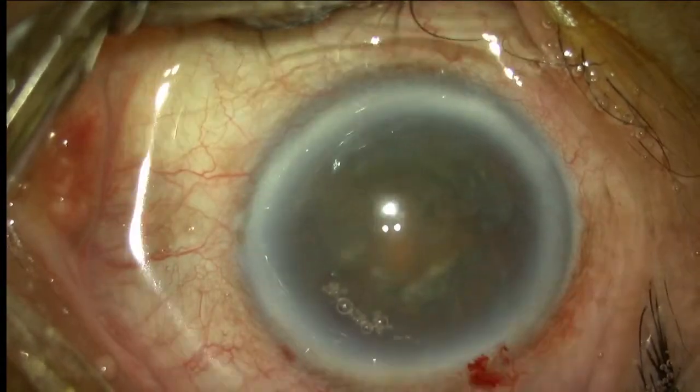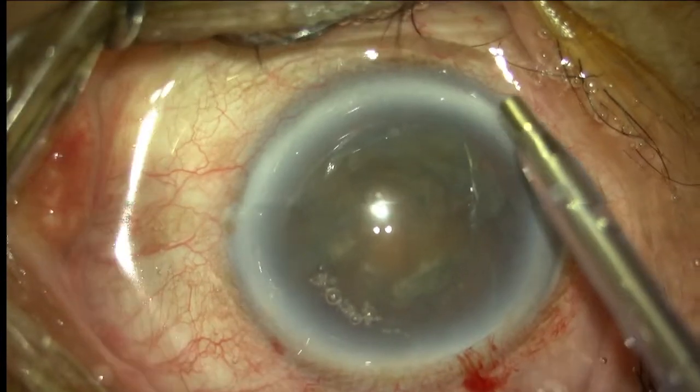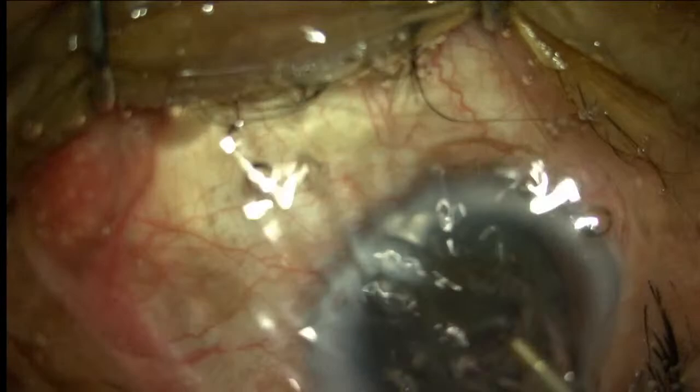So you have to pull this sleeve a little more because you want the tip to be exposed at least 1.5 to 2 millimeter because you have to get the hold of these hard nuclei.